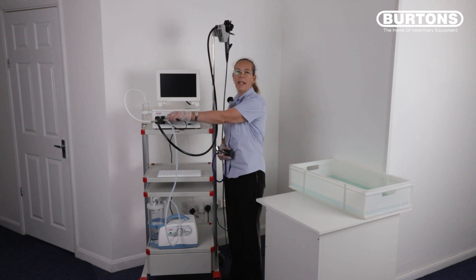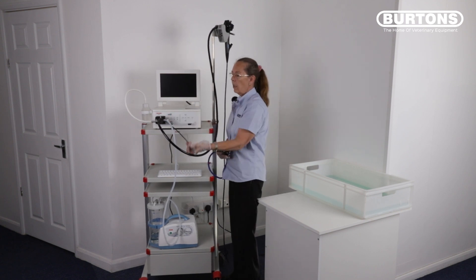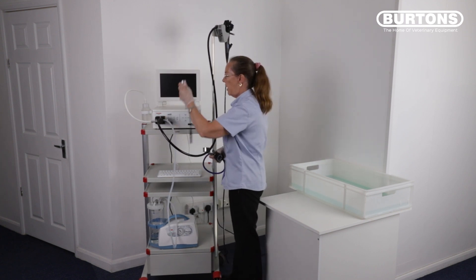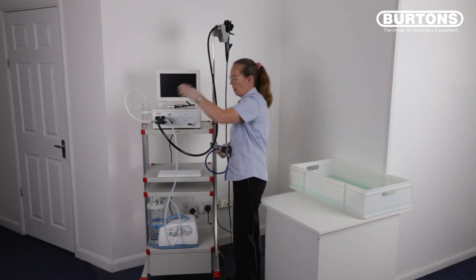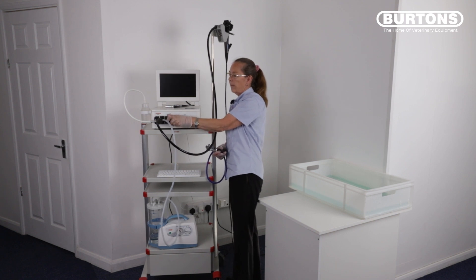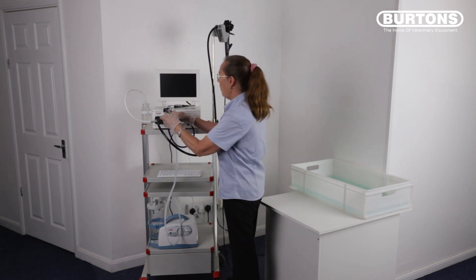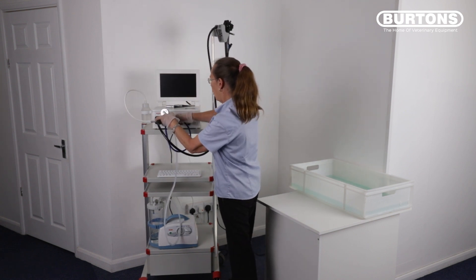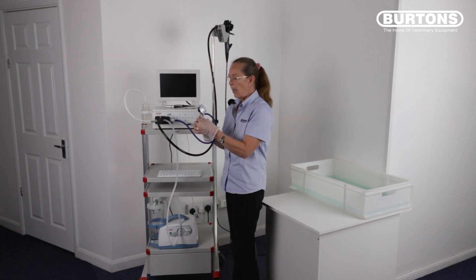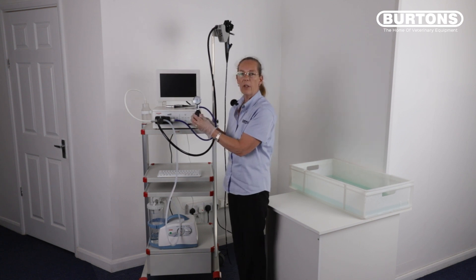It is imperative that you do a leak test prior to any immersion and any cleaning and disinfection. Remove the signal cable from the video processor and connect the waterproof cap. Connect the leak tester to the waterproof cap, ensure the needle is set at zero and inflate to the test zone, which is approximately 12 o'clock on the dial.